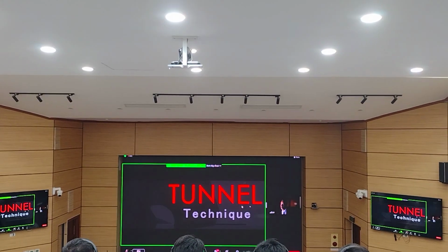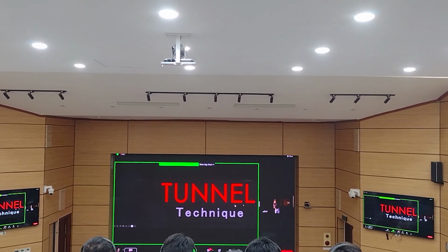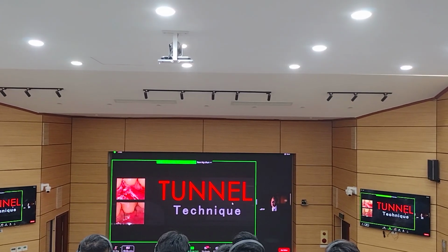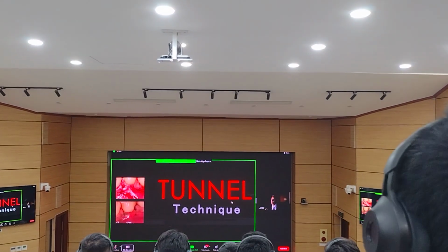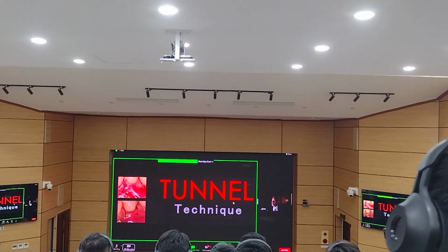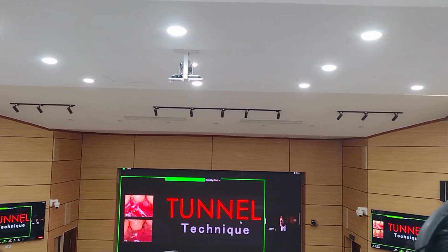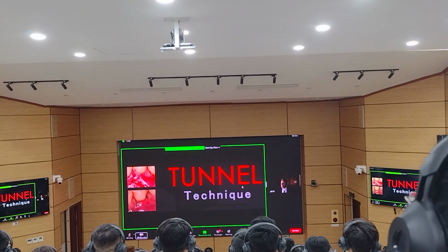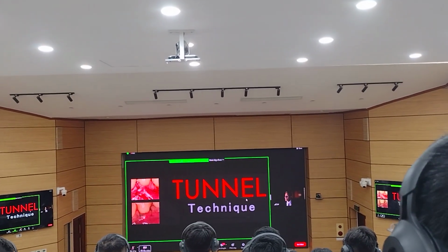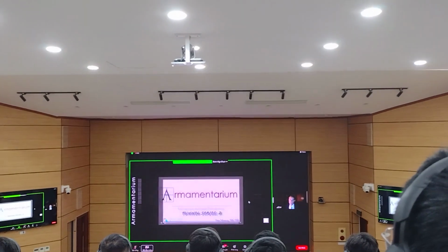So it is important to understand that perhaps our version of responding to the minimally invasive procedures is the tunnel technique. And the tunnel technique has, as one of its contributions, that we are avoiding the vertical incisions that we used so often when we were designing our coronally advanced flaps. It has all become a coronal advancement with the elimination of vertical incisions, which is probably the biggest contribution.